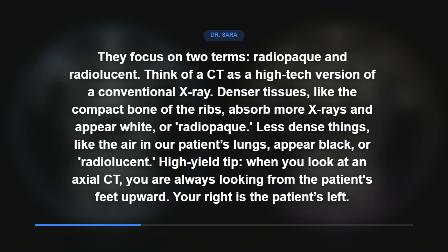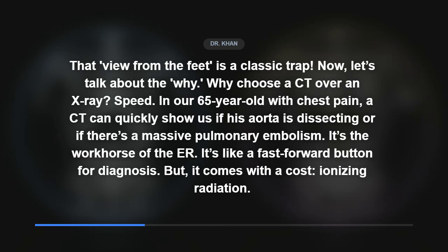High-yield tip. When you look at an axial CT, you are always looking from the patient's feet upward. Your right is the patient's left. That view from the feet is a classic trap. Now, let's talk about the why. Why choose a CT over an X-ray?